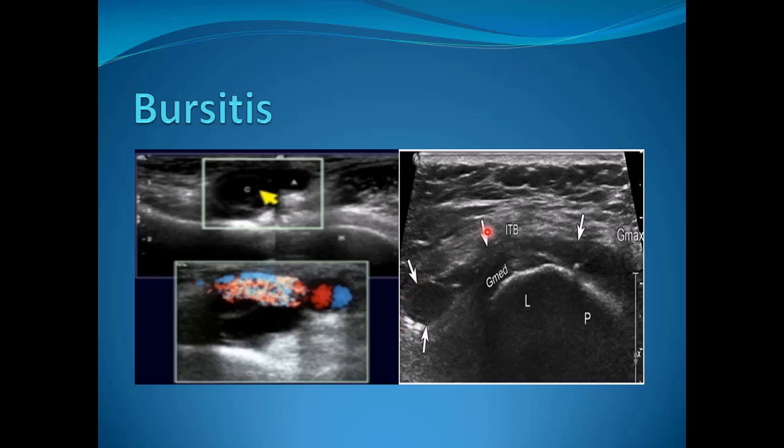This is another example of trochanteric bursitis, shown here adjacent to the gluteus medius tendon.